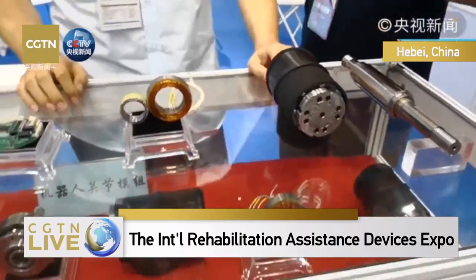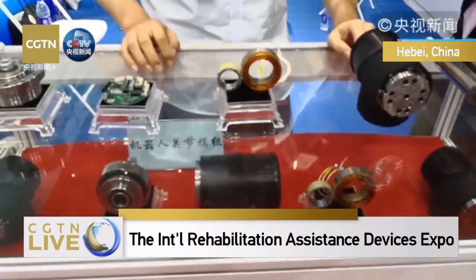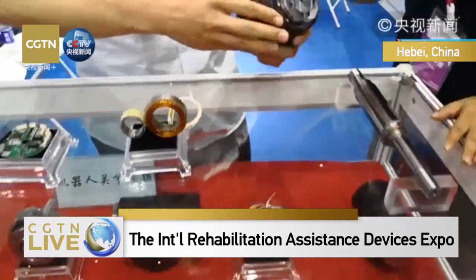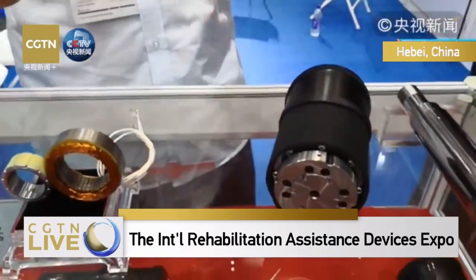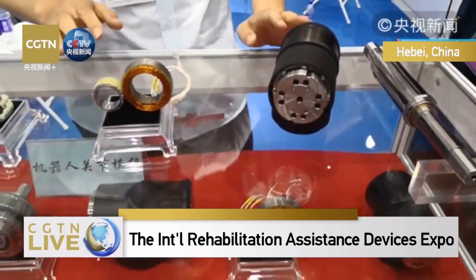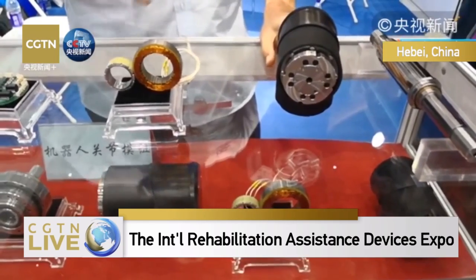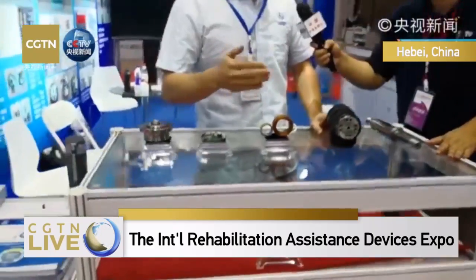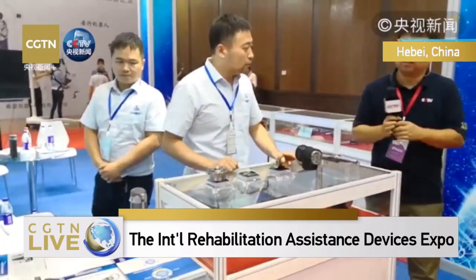That is to say, for the other enterprises, they can just focus on the intelligent technologies part, and they can purchase the parts from us. You don't have to worry about the development and research and making of the joint. You can focus more on algorithm and smart technologies and so on. And our cost is about 1/3 to 50% lower than foreign manufacturers.